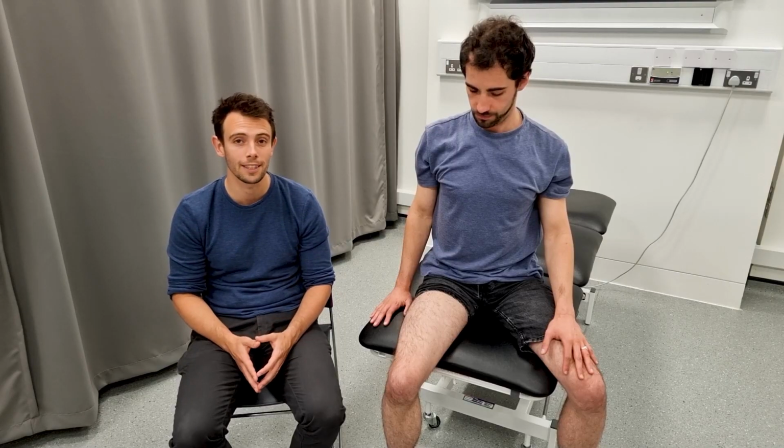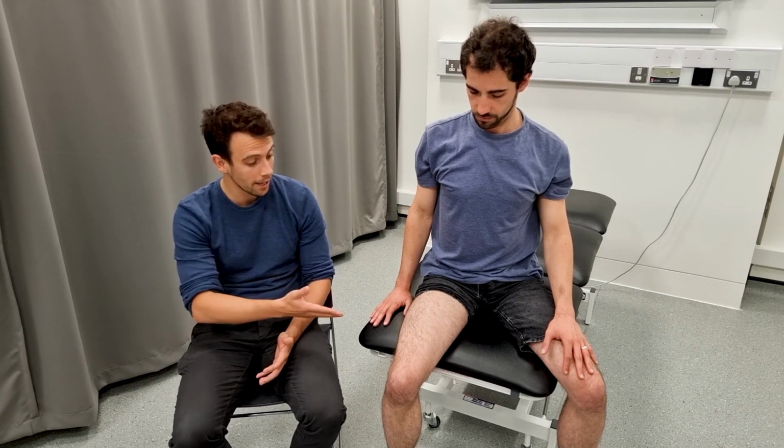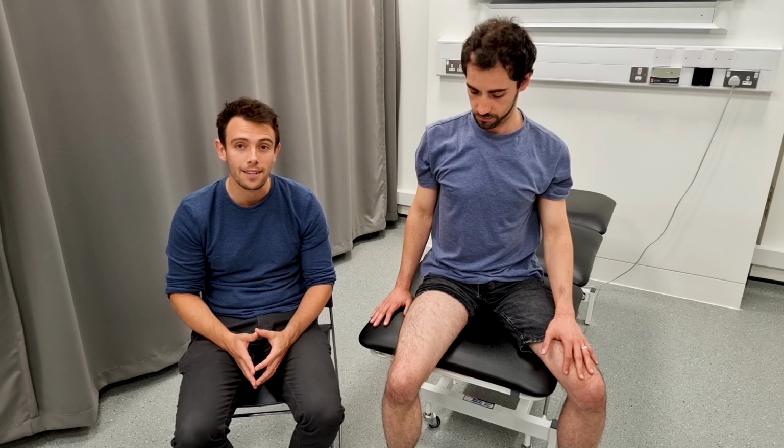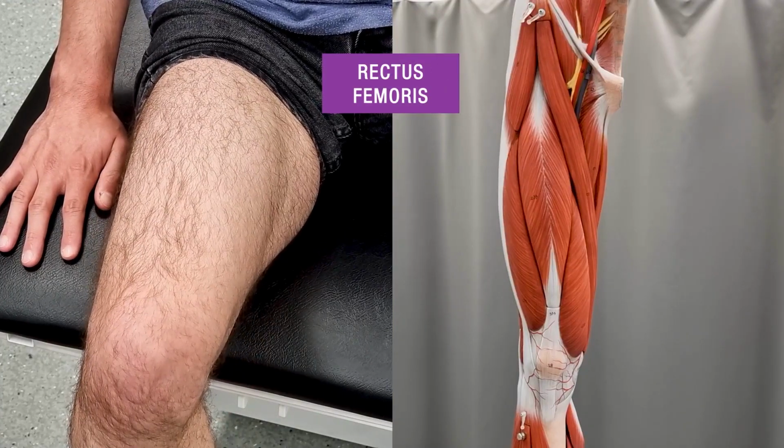In this video, we'll be exploring the surface anatomy and ultrasound images of the femoral triangle and also the anterior and medial thigh. To begin with, we're going to look at the surface anatomy of the anterior thigh, and we'll also look at the knee. So with our patient here seated on the end of the bed, if we ask them to just raise the knee off the end of the bed, we'll emphasise the rectus femoris muscle.